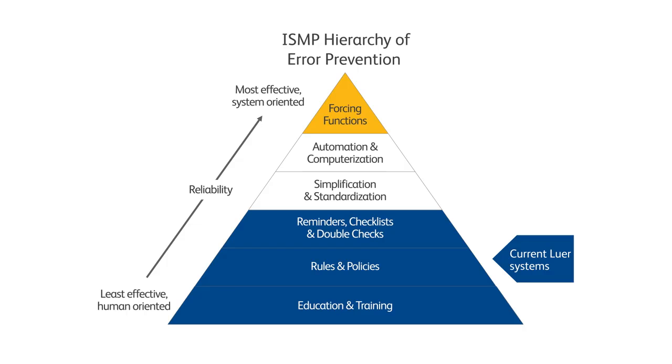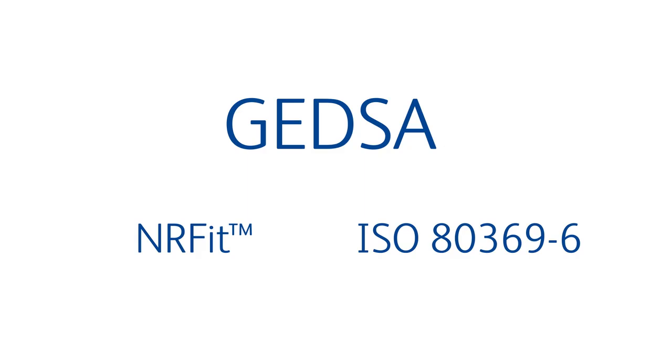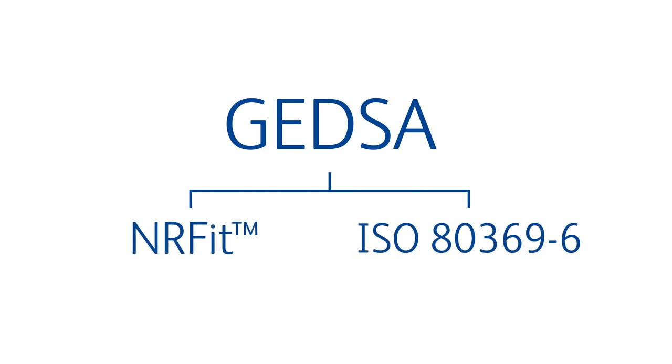For ISO 80369-6 neuraxial applications, products with this design are called NRFit devices. NRFit is the name selected by GEDSA, Global Enteral Device Supplier Association, and members of the ISO Joint Working Group to denote neuraxial anesthesia devices compliant to ISO 80369-6, but the NRFit name is not part of the standard itself.